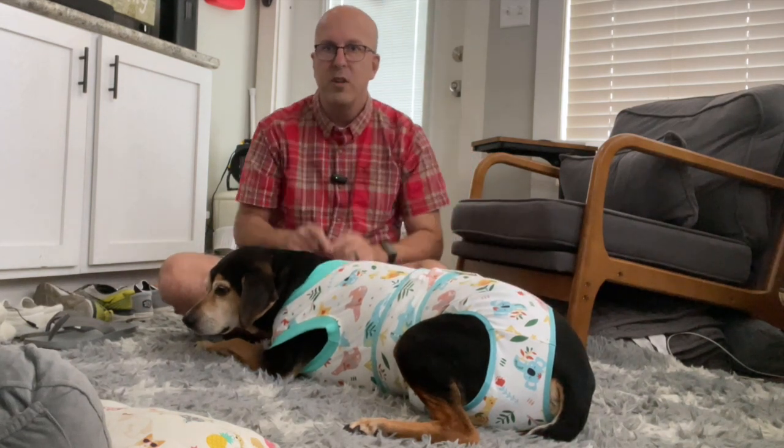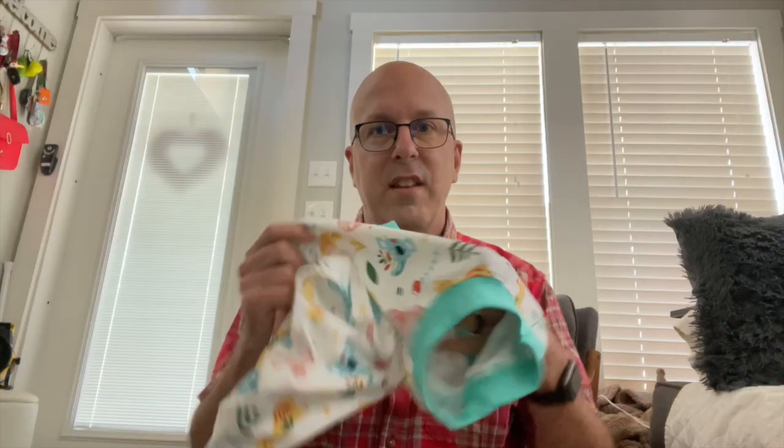Let me take the suit off Tucker and we'll take a bit of a closer look. Tucker's found his way to the couch now that he has this off, but this is extremely comfortable. It's a very nice fabric, and it's a lot easier to put on my pup than to put the cone of shame on. It comes in sizes from small to extra extra large, and you just have to measure your dog in three areas to make sure you get the perfect fit.